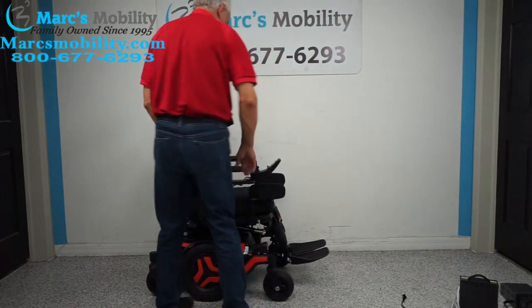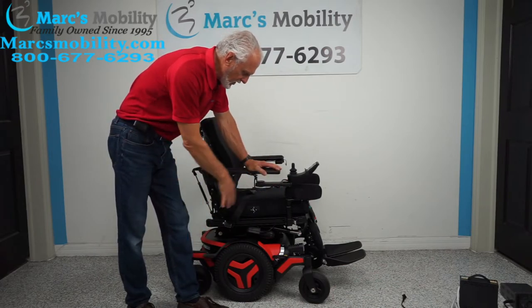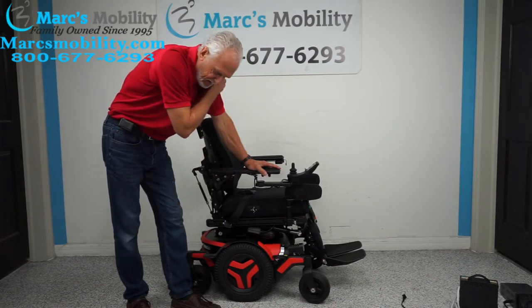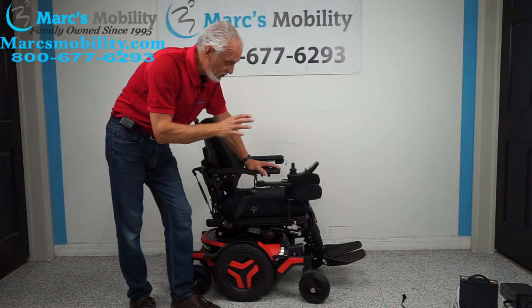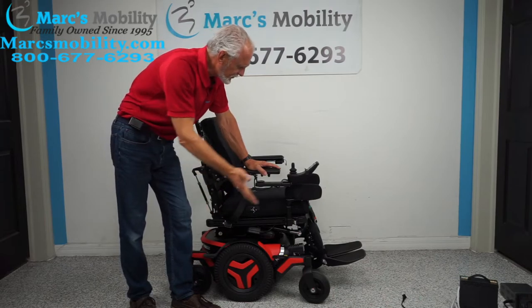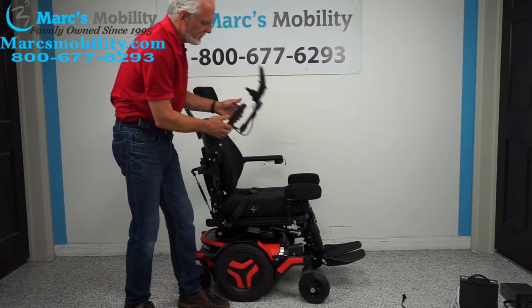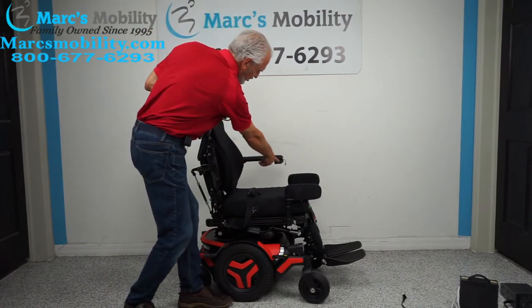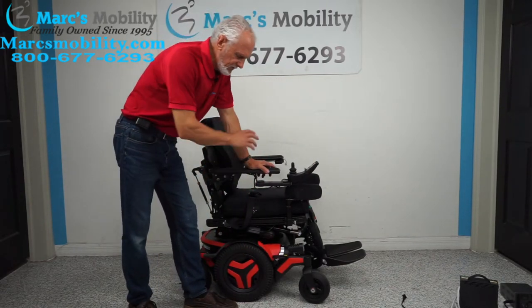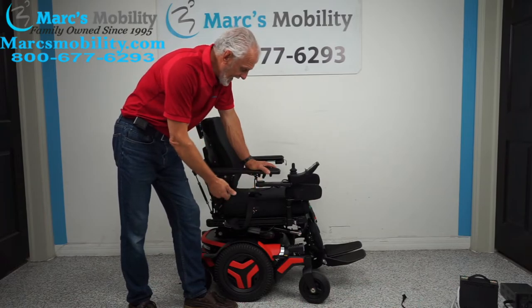Let's recap. This is a Permobil M3 mid-wheel drive — one of the best chairs. It has 15 miles and was only used for a couple of weeks. It has five electrical functions: the 12-inch seat lift, the electric tilt, the electric recline, the electric legs, and the anterior tilt. It also has the swing-away joystick, flip-up arm, lateral knee pad, safety belt, air cushion, USB port, adjustable headrest, headlights, anchor points, and solid tires. This is the top of the line in power chairs.